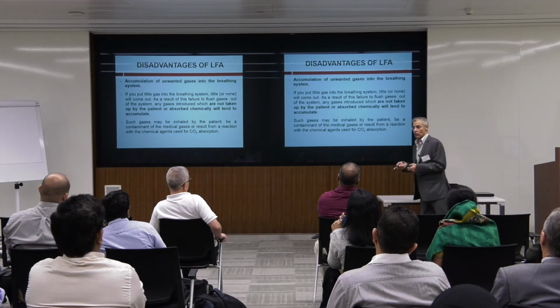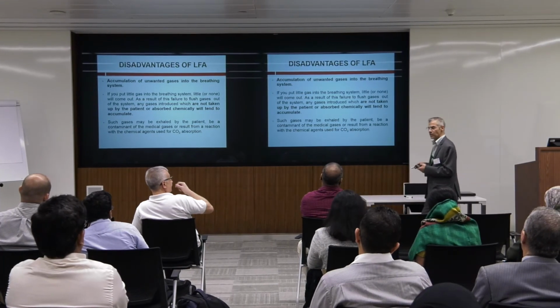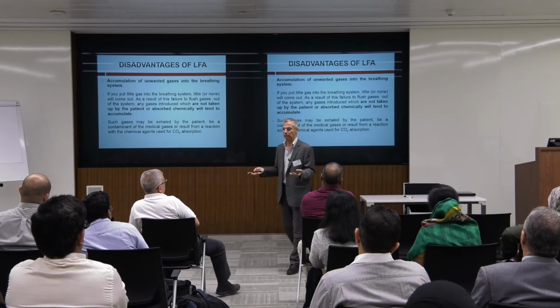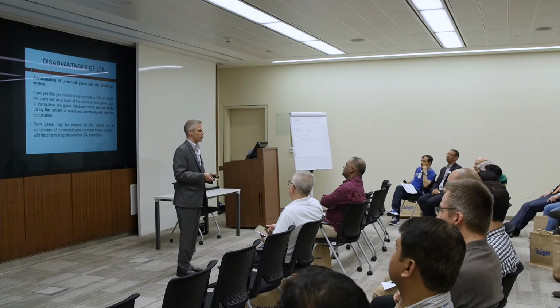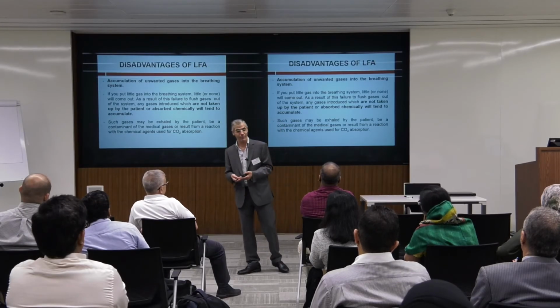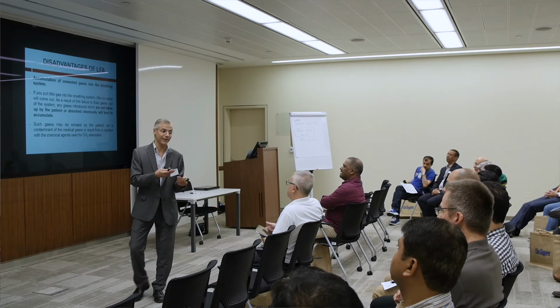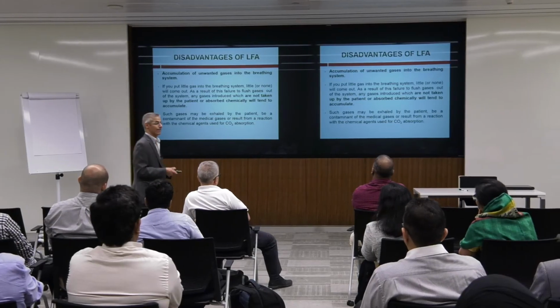What are the disadvantages of low flow anesthesia? Accumulation of unwanted gases into the breathing system. We may have any other kind of gas rather than oxygen, nitrous, and inhalational anesthetics. We may have it. Like what? Helium. Yeah, helium. CO2, it will be washed totally. And what else? What do you think, rather than helium? Any other more significant gases?